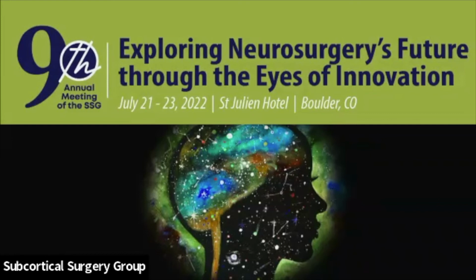And similarly here, if we window it and we see that the tracts are where they're supposed to be, and they stop at the gray white matter interface, and they're not in the CSF spaces, then that makes us feel like they're reasonably anatomically accurate. And that's why the surgeons in the survey were asked, is the white matter interface clear? Are the deep nuclei as you would expect them? It is not a picture that is a perfect picture of the histology, but to assume that human optics is any better is, I believe, also untrue and perhaps naive. You know, what we do with our open eyes, or, you know, yes.